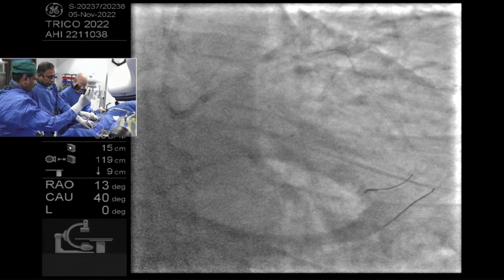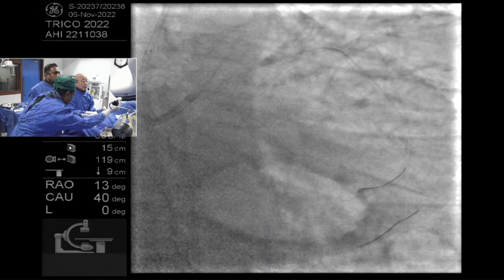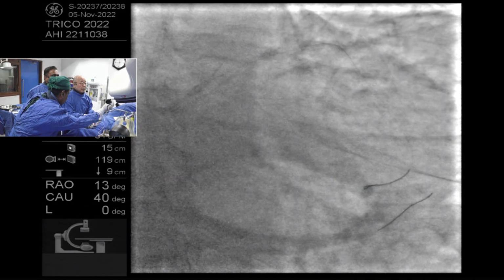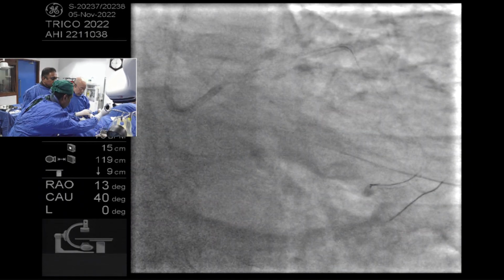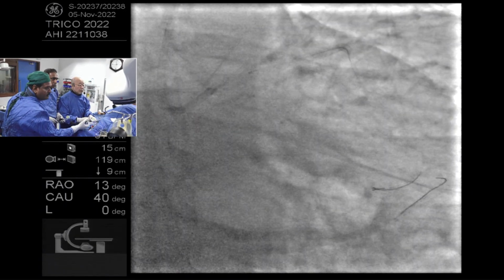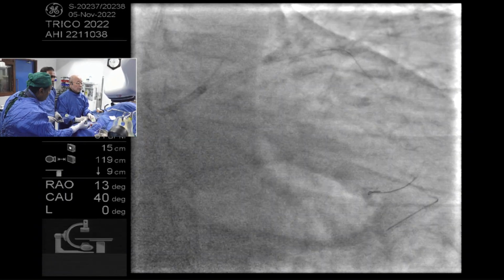So on a hemodynamic problem you will not have one. Once you have a kissing in a relatively short proximal part of the stent and two big side branches, the geography of that stent could be deranged, you can have dissection. So I would also be keen not to do it if it's not necessary.